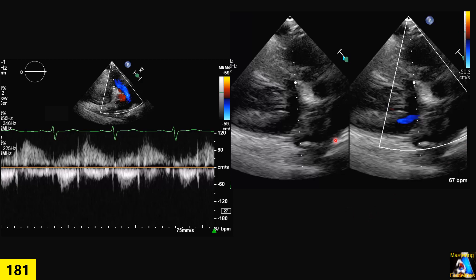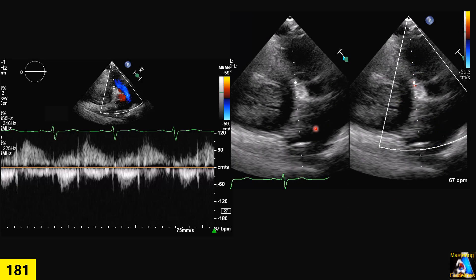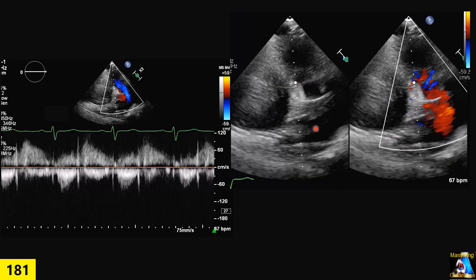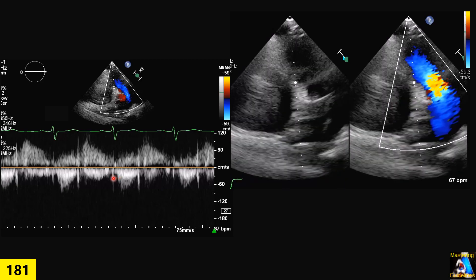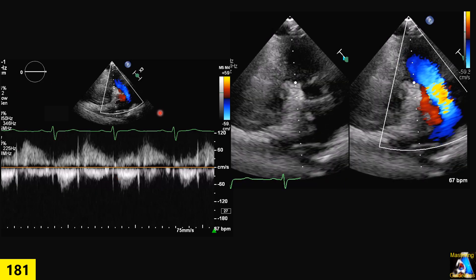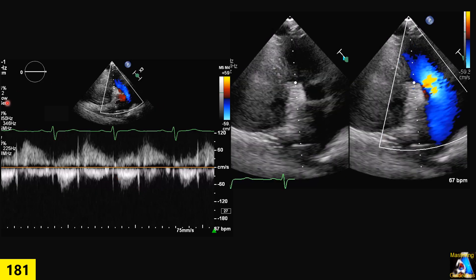On that view, we performed a continuous wave Doppler and we got this Doppler tracing for that area.